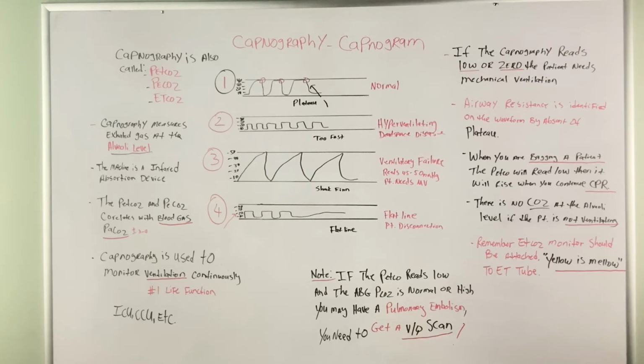On number 3, we call it a large shark fin. The capnogram is reading nearly up in the 50s. This represents ventilatory failure because the reading is above 45, and this patient needs mechanical ventilation.